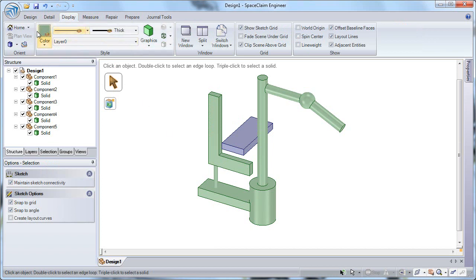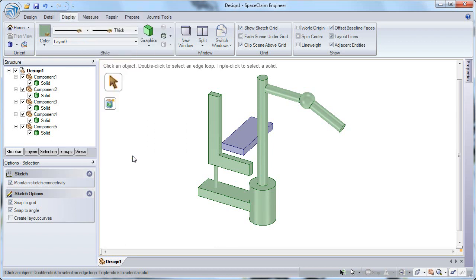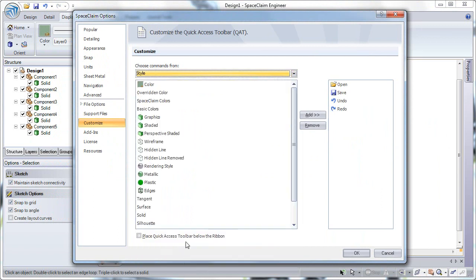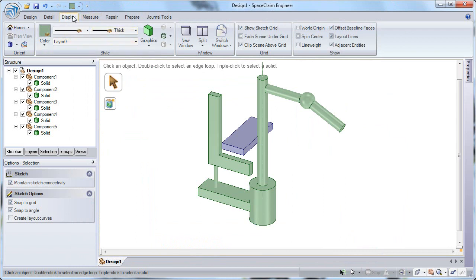Now, if I'm going to be changing colors on a lot of my components, I can add that to my Quick Access toolbar by clicking on the drop-down from the Quick Access toolbar, choosing to edit my Quick Access toolbar. And when I go to Customize in the Options menu which pops up, I can search for that under the Style group, choose Color, and add that to my Quick Access toolbar. And now you see that Color tool appears next to Undo and Redo in the Quick Access toolbar. I can select an edge of my part, go to my Quick Access toolbar, and change the color of that part.